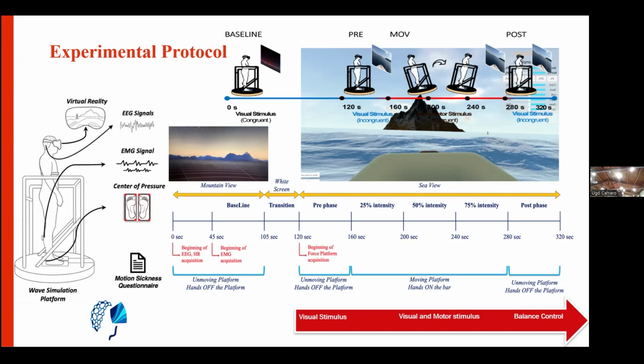Immediately after the moving scenarios, it's accommodated and synchronized with the platform. So then they see and they feel. This stimulus increases over time until it's stopped brutally. And then they continue to see the stimulus, but there is no movement. So in this way, we have a big chance to understand and predict what is happening in the brain.